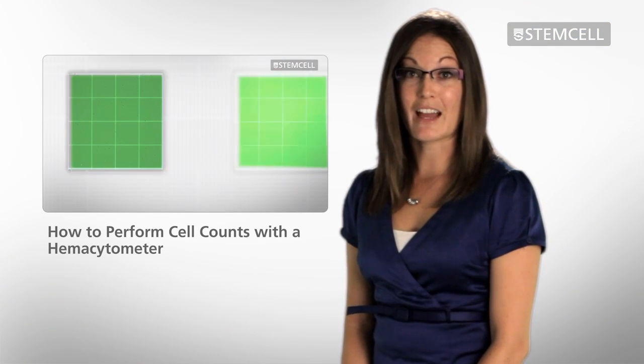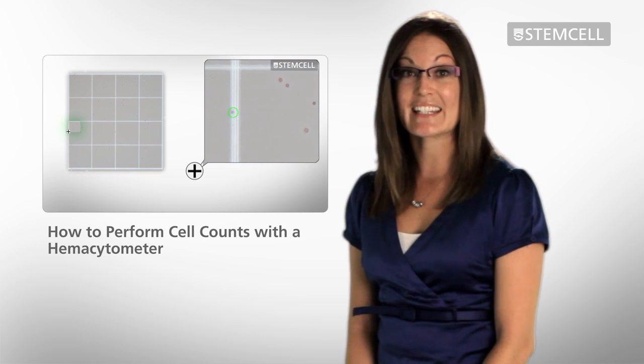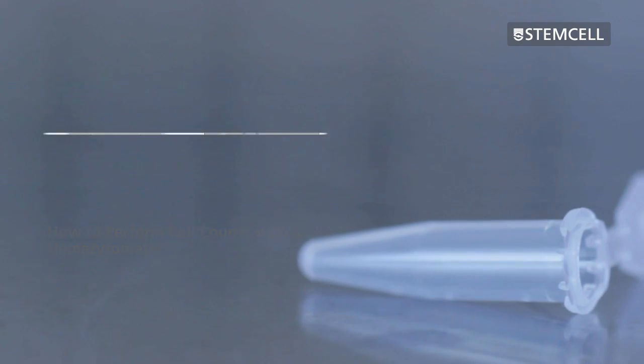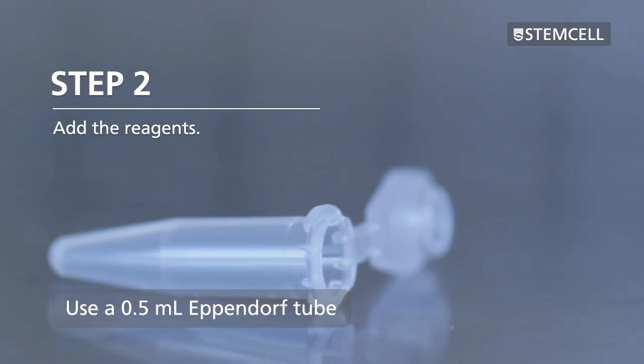For more information about cell counting, please see our technical video for performing both a nucleated and viable cell count. For the HetaSep small volume protocol, use a 0.5 ml Eppendorf tube.